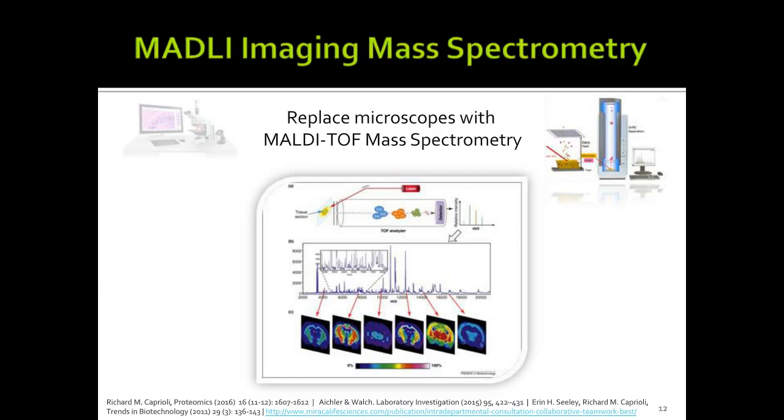So that's how we get this. Now we're talking about those slides. This is the average spectrum of molecular weights across hundreds of thousands of spots. Put together, we can view the compounds or analytes in this fashion, and then we can identify the boundaries or differentiate normal versus malignant tissues. So this is the general idea.